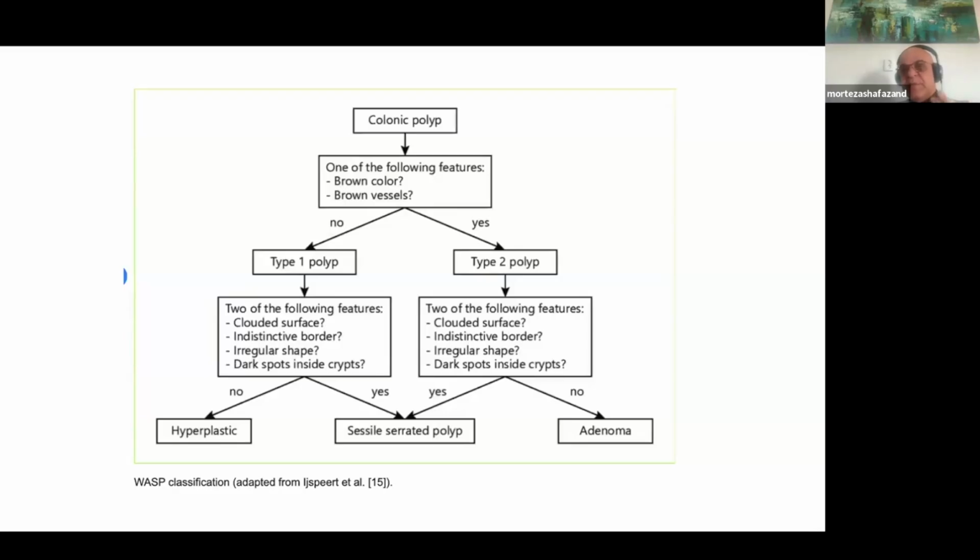Exactly. In those cases, with a low-risk patient, I look at the right colon only with NBI. If the patient is high risk, I put the acetic acid and look with the NBI. Yeah, I fully agree with you there.